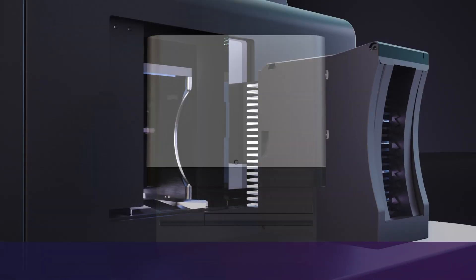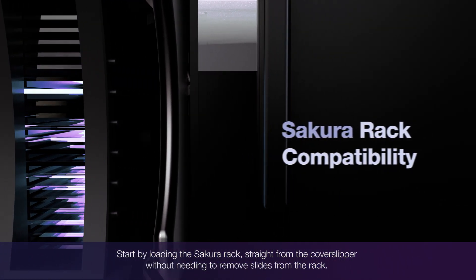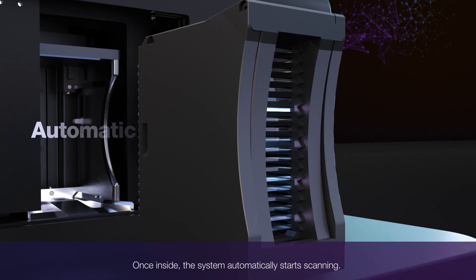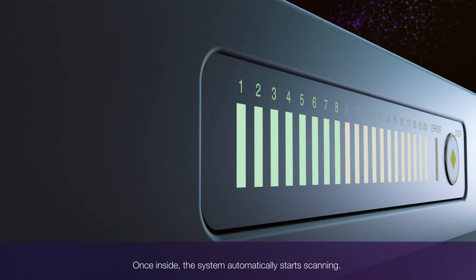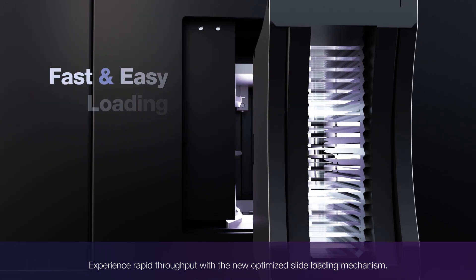Start by loading the Sakura rack straight from the cover slipper, without needing to remove slides from the rack. Once inside, the system automatically starts scanning. Experience rapid throughput with the new optimized slide loading mechanism.